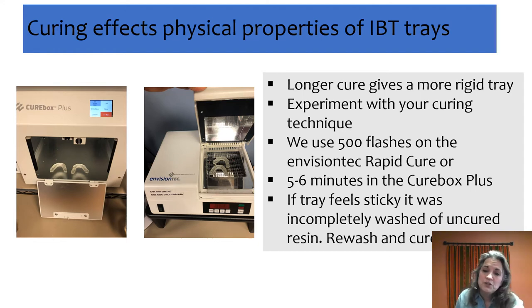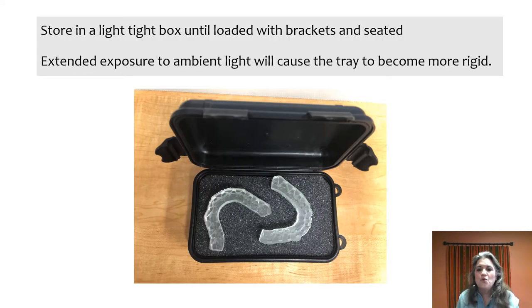When you're done with the cure process, if it feels tacky or looks shiny, go back and rewash it — you have some uncured resin there. Once you're finished curing, I recommend putting the tray in a light-tight box. If you just leave it sitting on the counter, ambient light will continue to cure it and it will get more rigid over time.